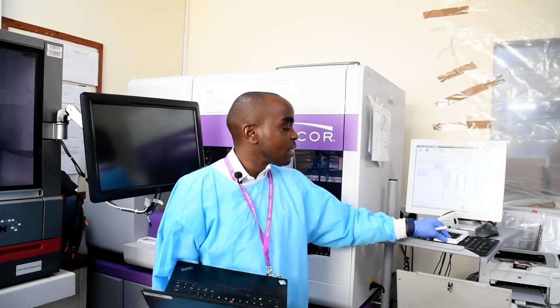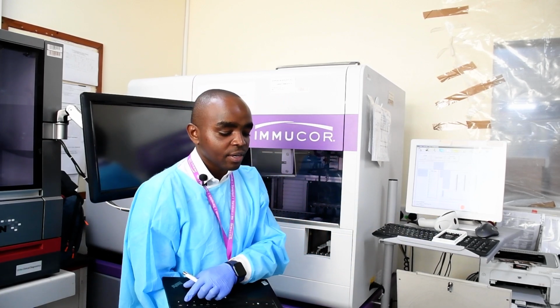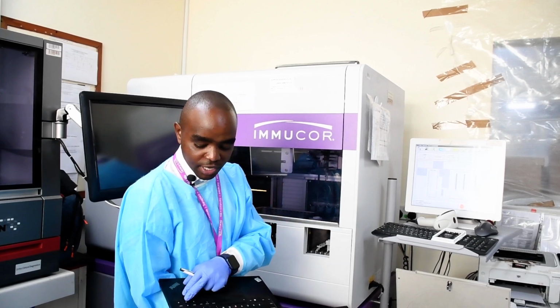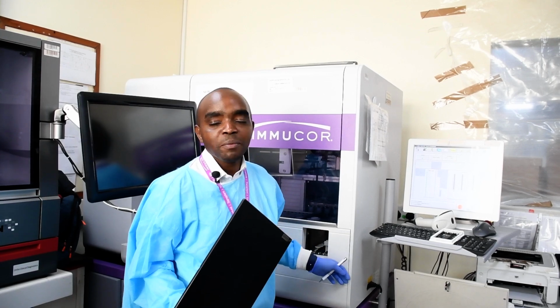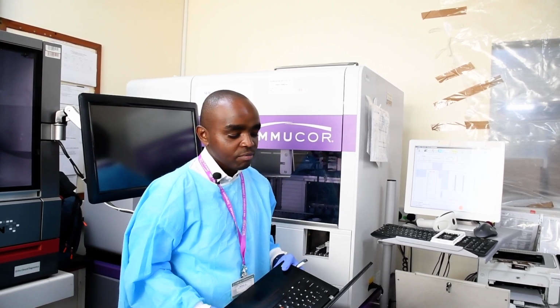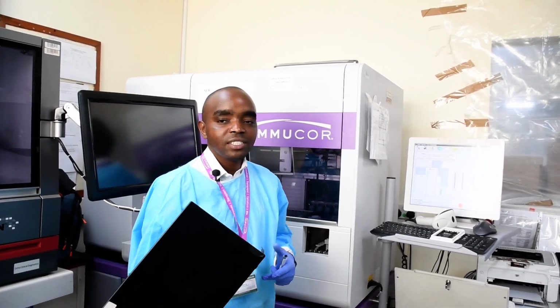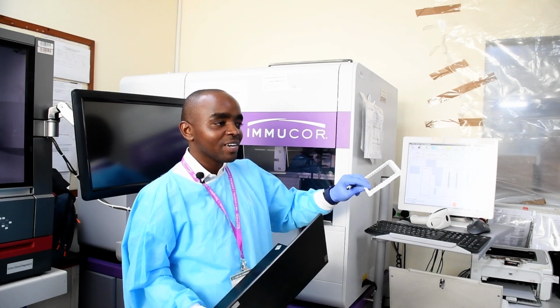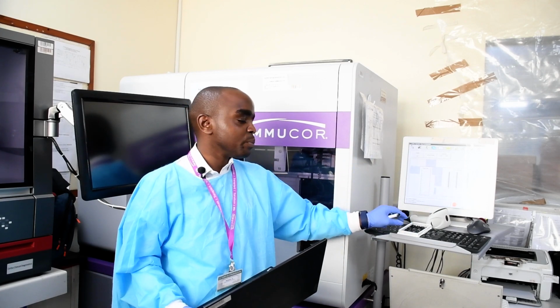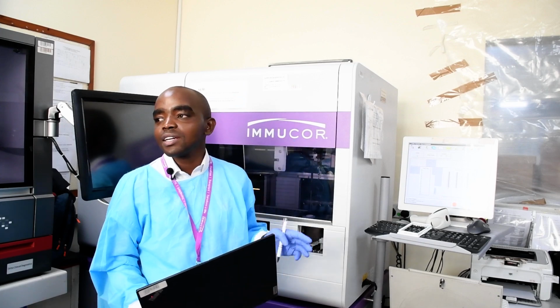So that is one of the advantages of this procedure. And of course, this one is less time consuming and reduces reporting errors. You can imagine reporting manually: one person sees +1 here, and another sees +1 in another place. But this one is automated. It will give you an outright result.